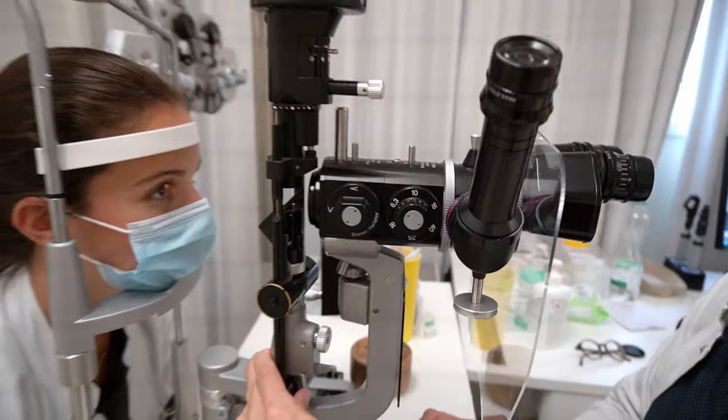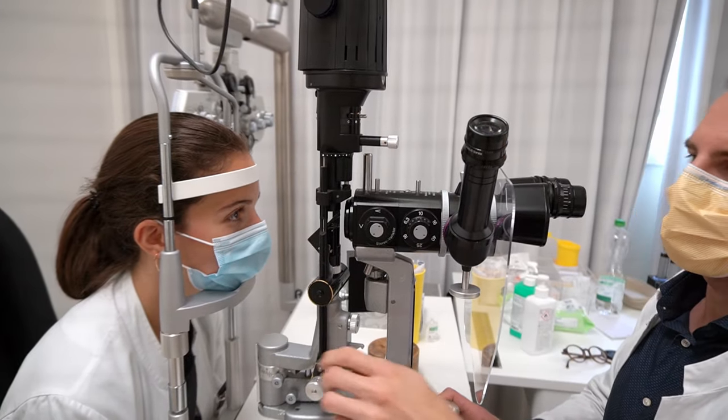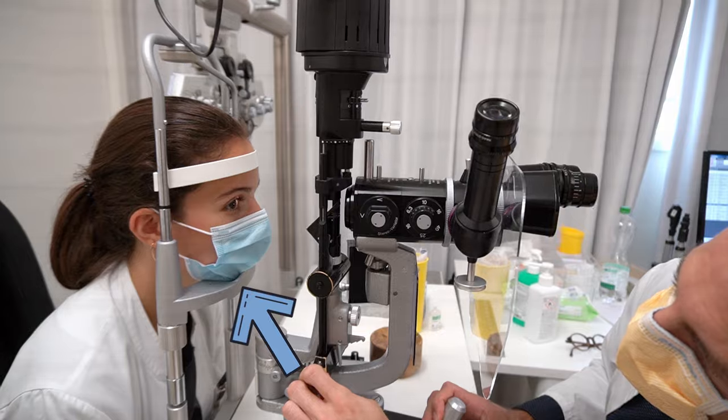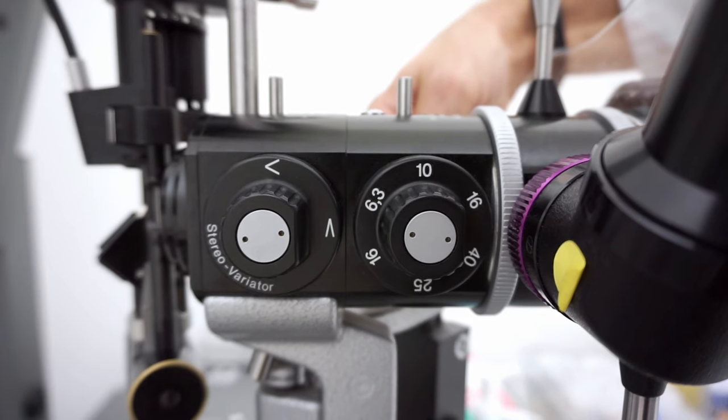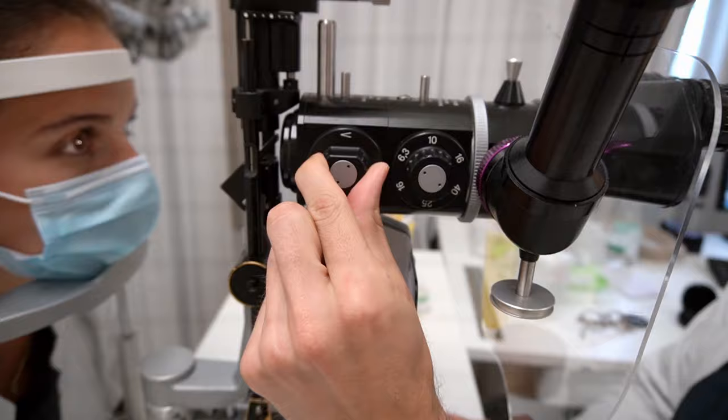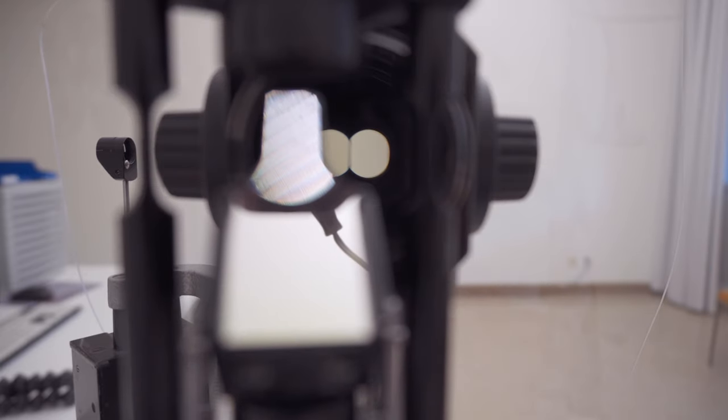So now that you understand what each of these moving parts does, let's learn how to look around the eye to find the parts of the retina that you're interested in. First, let's start with how to set everything up. Have the patient put the head on the chin rest. Set the slit lamp magnification to 10. If you have a stereo variator, set it to narrow and put the tower one increment to the left or to the right.